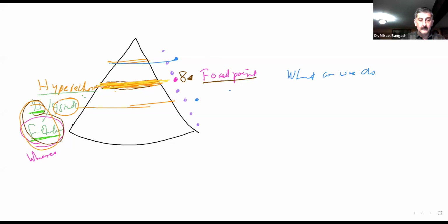Whether it was due to focal enhancement, because this was your focal point, or the other way around, you can always reduce your TGC, and it may make it slightly darker, or reduce its brightness. Any questions?